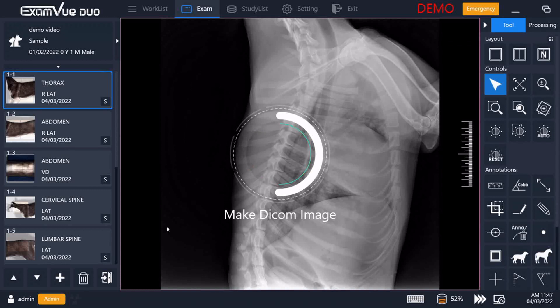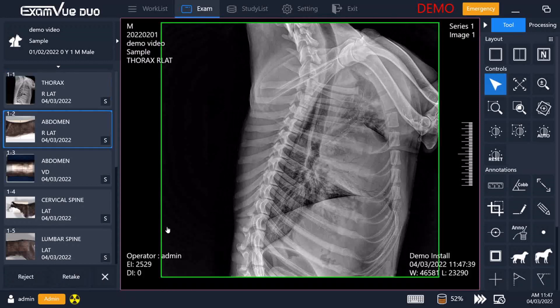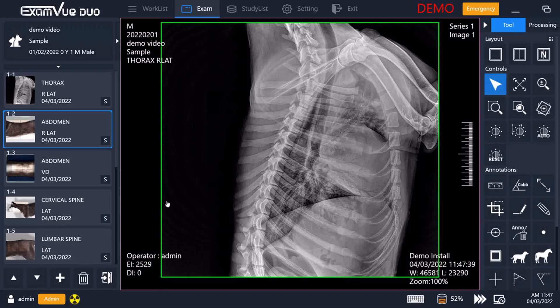You will see in a moment that it will give you the option to reject or keep this X-ray. You can also simply ignore this and move on without needing to redo it.